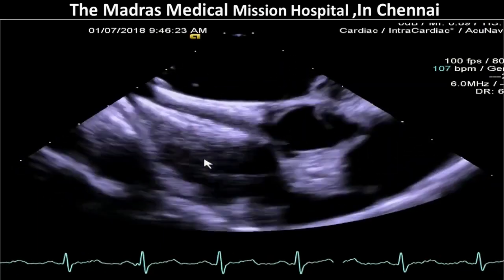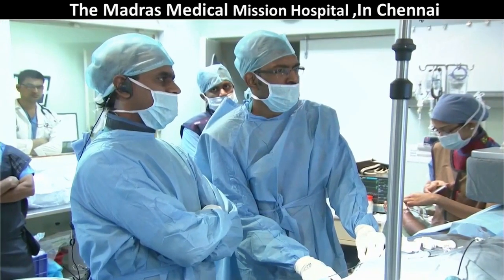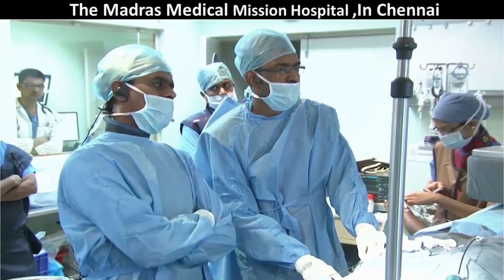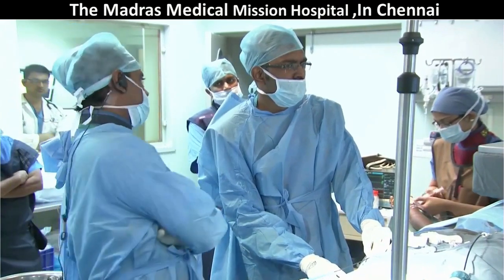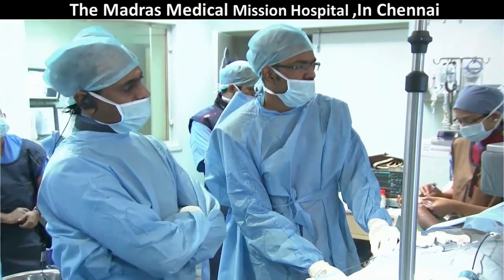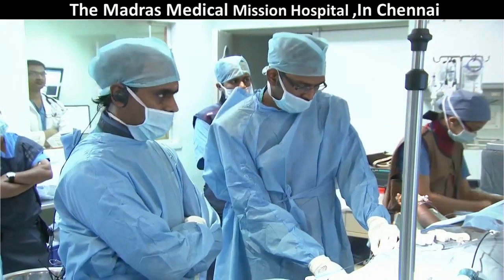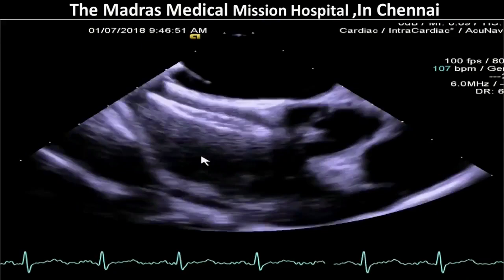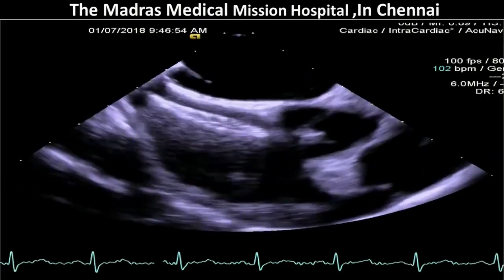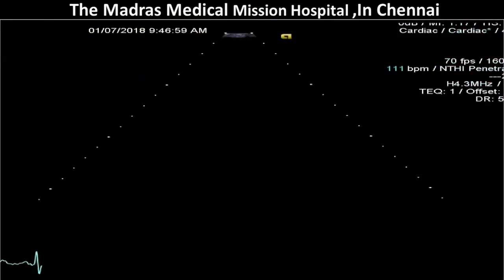Okay. The downsides are you need another vascular access, but the positive side is the patient will be conscious and watching the procedure. There is no sedation, there is no respiratory embarrassment caused as with a transesophageal echo, and we don't need ventilation. So you can avoid that. Dr. Ramya, you can show one transthoracic echo so that people will be comfortable. So you can avoid the TEE altogether. Exactly, so that it is basically comfortable for the patient.